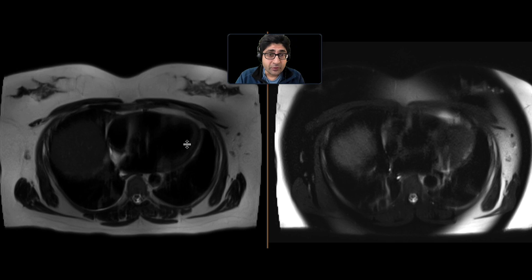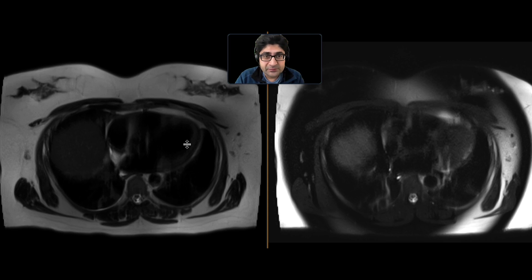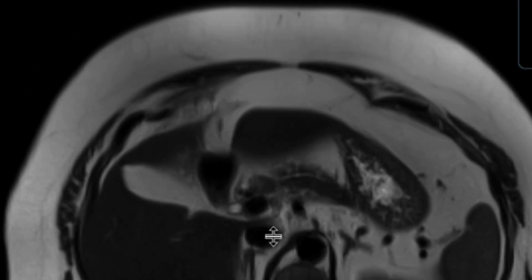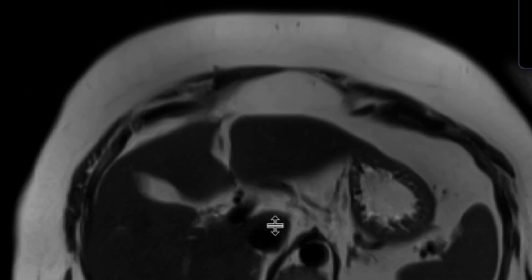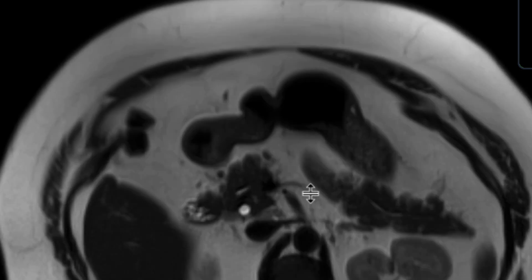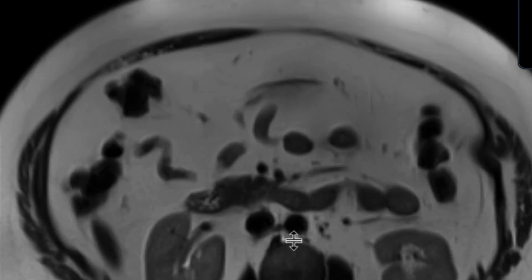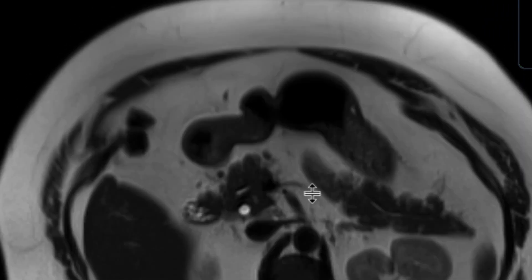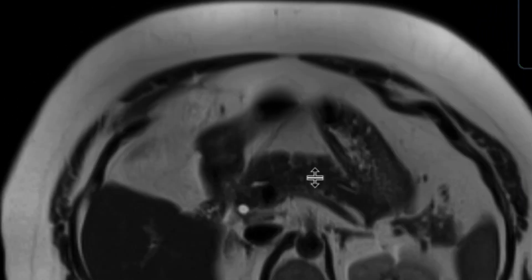This is a patient who came in with right upper quadrant pain, got an ultrasound that was non-conclusive and didn't really give a cause for the pain, so an MRI was performed. On the MRI in this T2-weighted image in the axial plane without FATSAT, the patient is status post cholecystectomy — the gallbladder has been out for about a year. There is no biliary ductal dilatation or any other cause related to the biliary tree for the patient's symptoms.